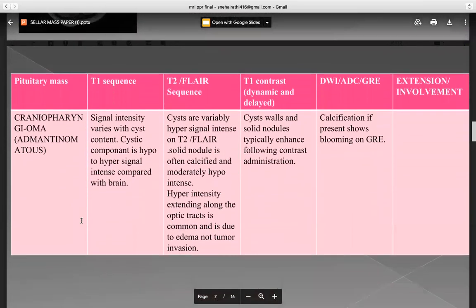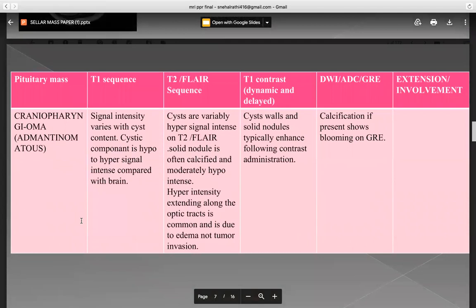The second lesion is craniopharyngeoma, adamantinomatous type. On T1 sequence, signal intensity varies with cyst content; the cystic component is hypo to hypersignal intense compared with brain. On T2 FLAIR sequence, cysts are variably hypersignal intense and the solid nodule is often calcified and moderately hypointense. Hyperintensity extending along the optic tracts is common and is due to edema, not tumor invasion. On T1 contrast dynamic and delayed, cyst walls and solid nodules typically enhance following contrast administration. Calcification, if present, shows blooming on GRE.